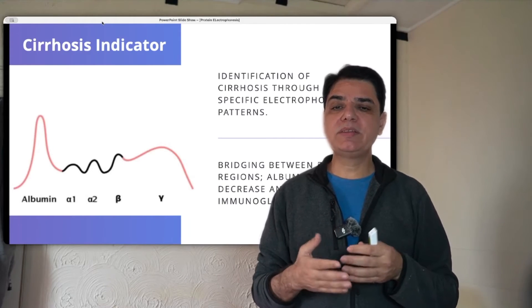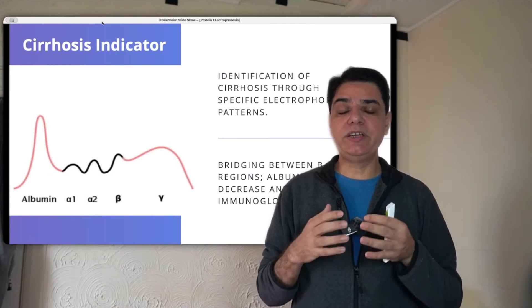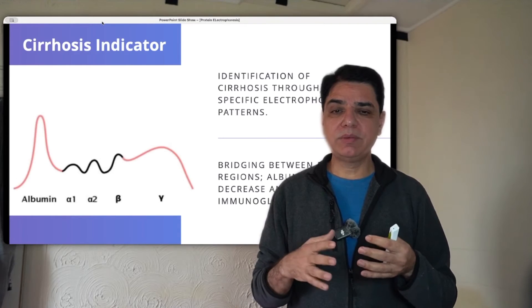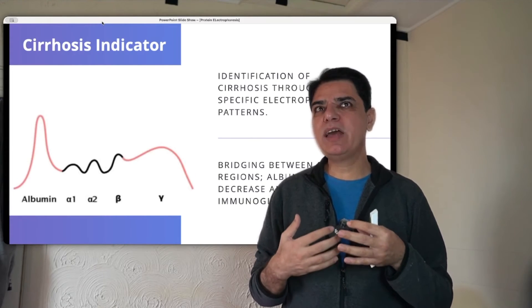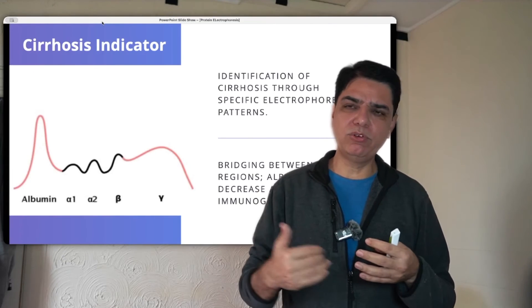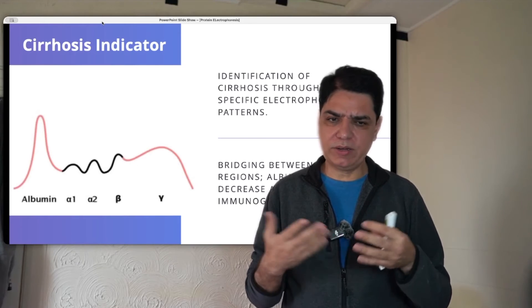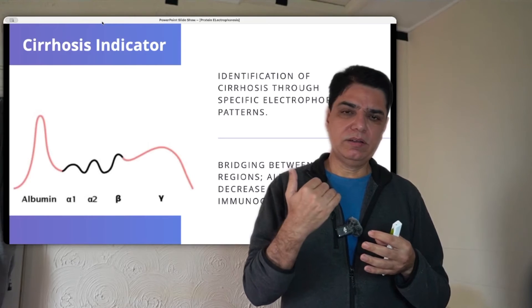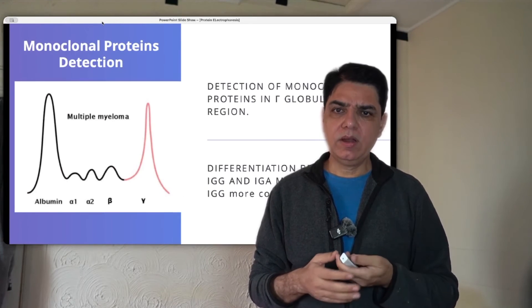This type of protein electrophoresis — showing decreased albumin with some increase in gamma globulins and some beta-1 increase with bridging — is indicative of liver cirrhosis. In cirrhosis, the liver cannot produce albumin, so albumin levels fall. At the same time, there is a compensatory increase in gamma globulin levels, possibly due to portal hypertension allowing gut antigens to bypass the liver, enter the bloodstream, and stimulate extra-hepatic production of gamma globulins. So in cirrhosis you get decreased albumin and a mild increase in gamma globulins.